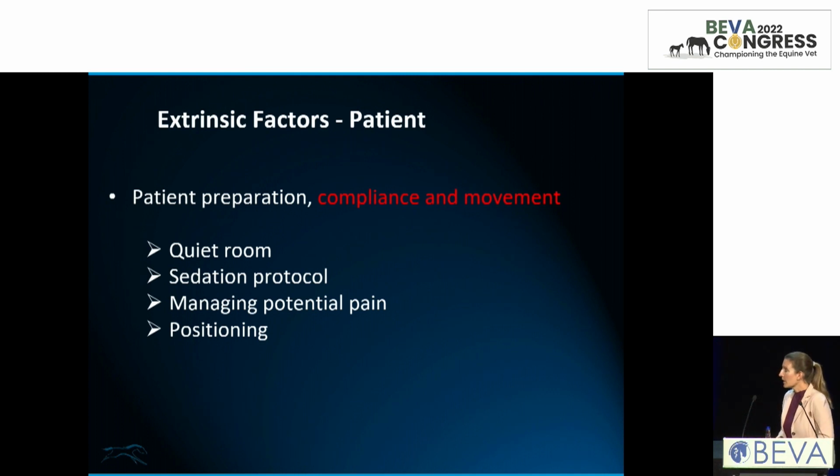Positioning, again, maybe during the clench check or whilst you were taking off the shoes, you realized that this horse prefers to stand narrow, wide, with the leg underneath itself a little bit more. These are things you need to pick up before scanning so you find the ideal position. I always feel it's better to spend a little moment longer in getting the horse comfortable the way it stands, and then not having to reposition and start your scanning again, or being disrupted because the horse is moving whilst we're then actually acquiring.